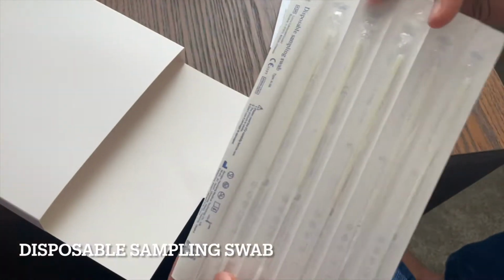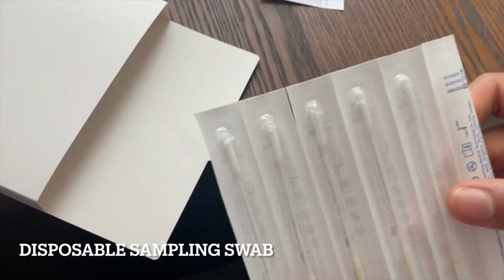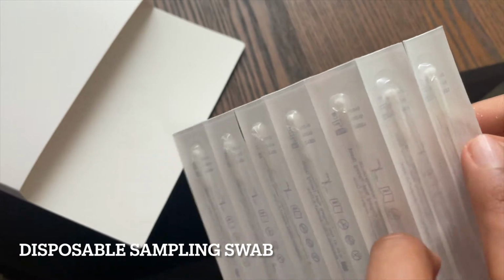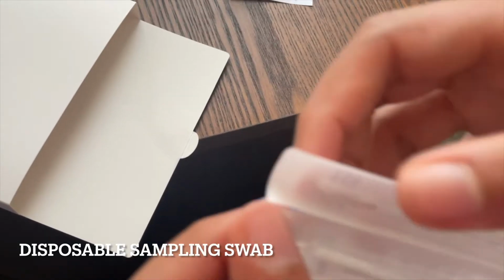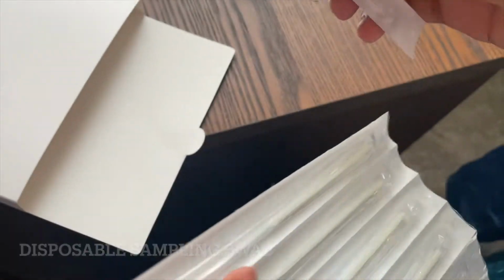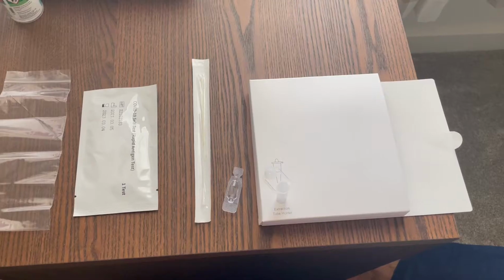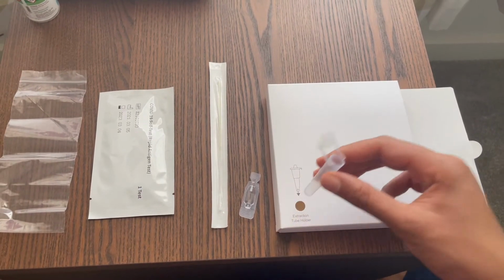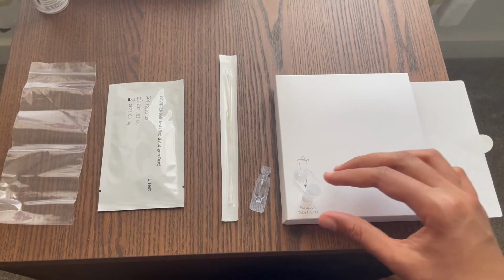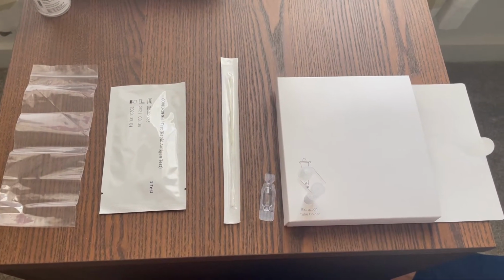Here are the actual swabs. As you can see here, we've got the ends that you're going to put in your mouth and nose over here, and you can just peel this off like this. It's quite easy. So guys, I've put this extraction tube into the extraction tube holder, and I've set that bit up, and here's everything that we need for the test.